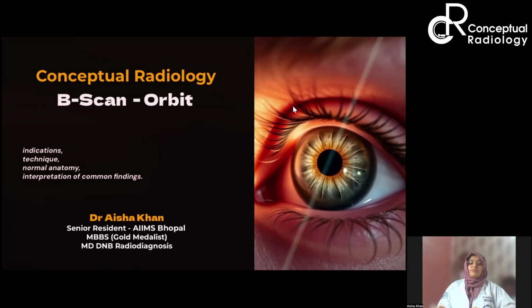In this lecture, I will be discussing all the important things about this particular modality, including its indications. After that comes technique. How are we going to perform this? Then comes the normal anatomy, which is paramount, because if we are not very confident about the anatomy, then we will not be able to interpret the findings correctly. And then comes interpretation of common findings and pathologies.